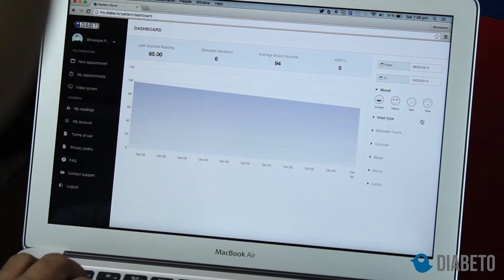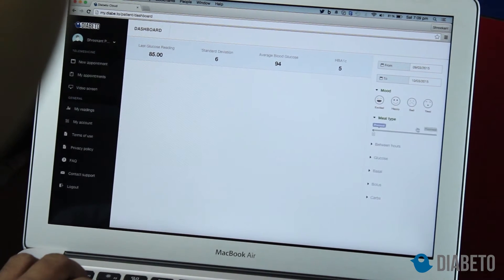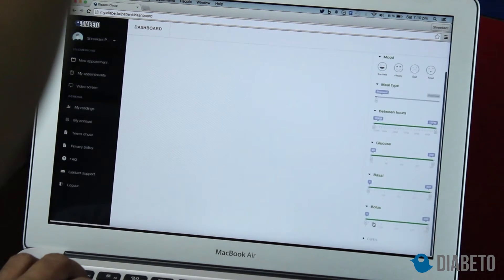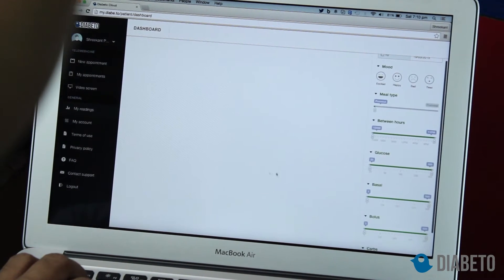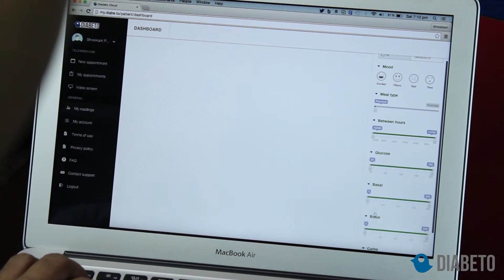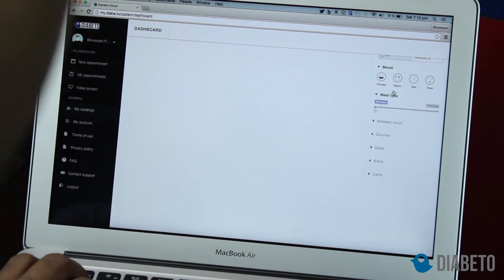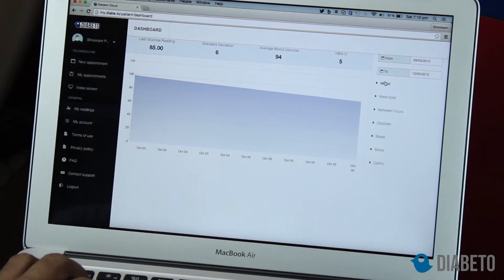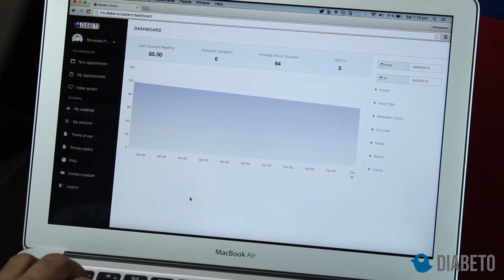An amazing feature here is that you can select and segregate the readings according to mood, meal type, hours, glucose, basal and bolus if you are taking insulin, and also carbs. Obviously there is no reading showing all these factors right now, so I'll deselect them. As you gather more data you'll see more readings, and it shows me the reading I had taken which is 85.